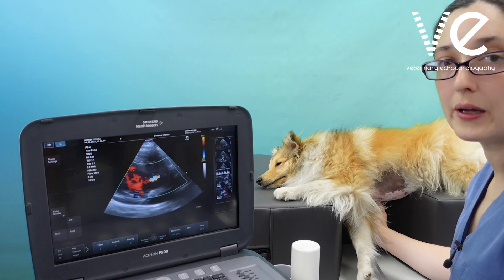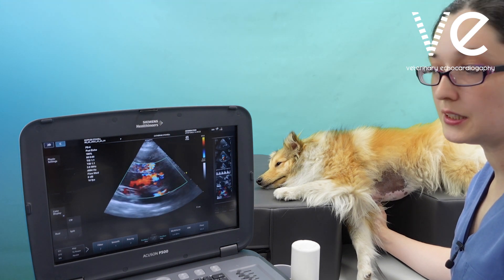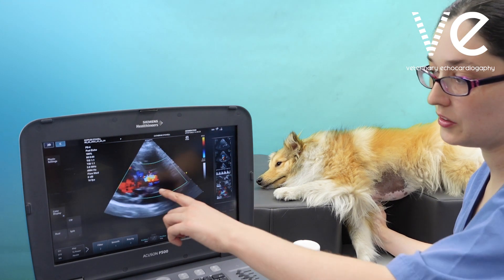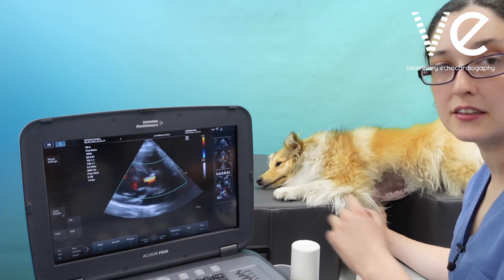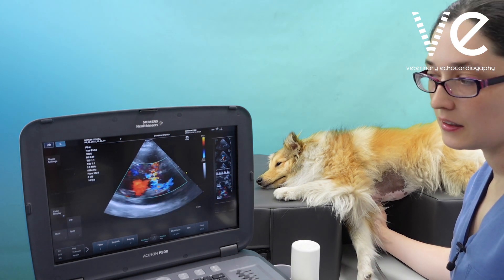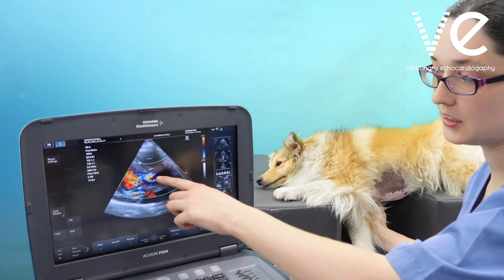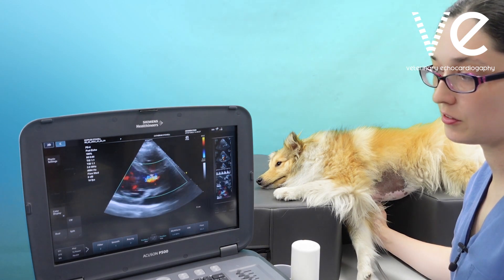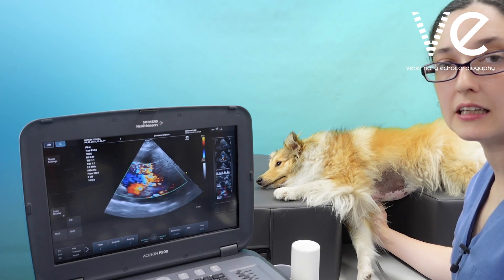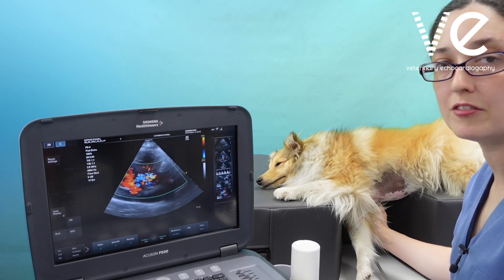In this dog we actually have two jets — one is the aortic regurgitant jet and one is a shunt through a ventricular septal defect.